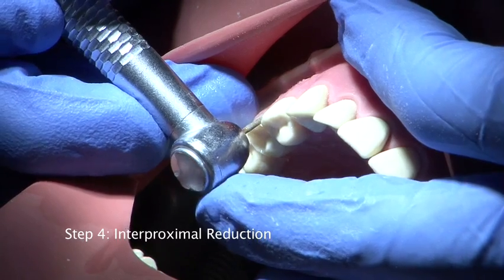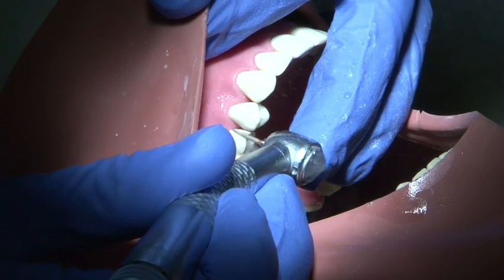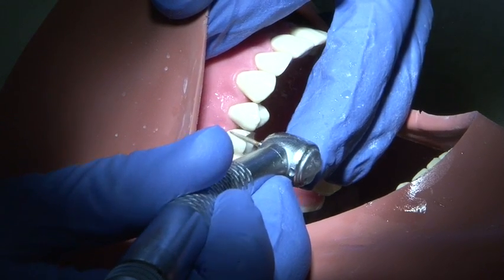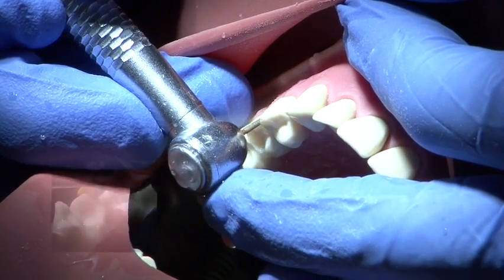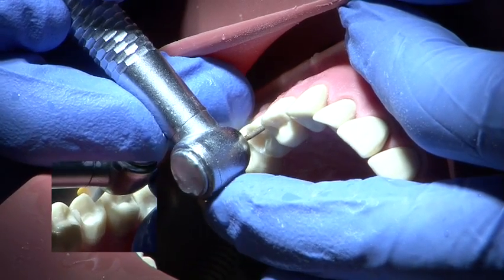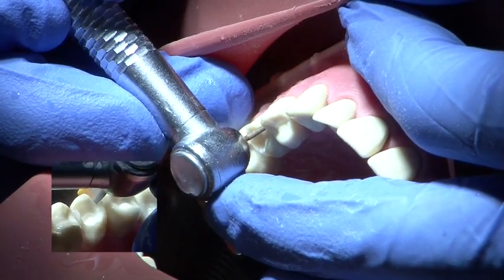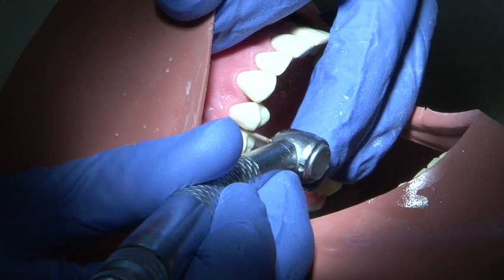Interproximal reduction is carried out using a fine pointed medium grit burr. The burr hand is supported by the free hand at all times and a smooth action is employed to avoid damage to the adjacent tooth. It is possible to insert a small strip of metal between the prepared tooth and the adjacent tooth to prevent damage.